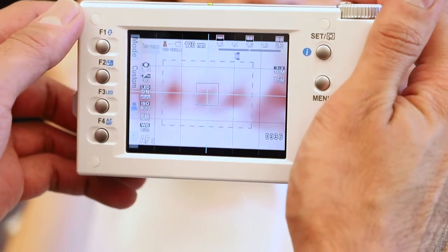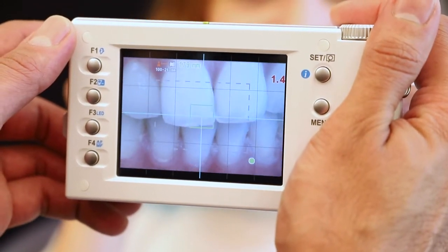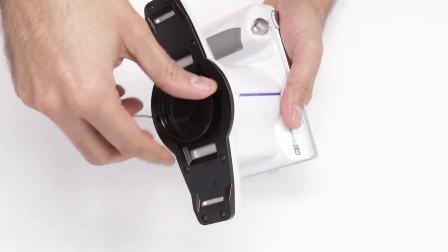The Telemacro mode allows you to accurately photograph details of anterior teeth. The iSpecial C3 includes a screw-on close-up lens for intra and extra oral close-ups.